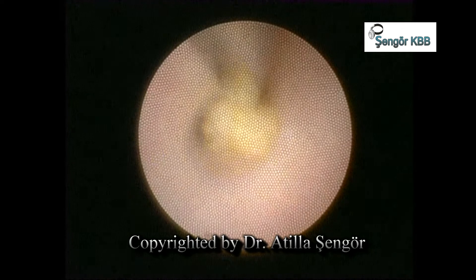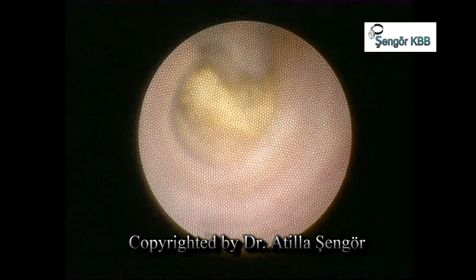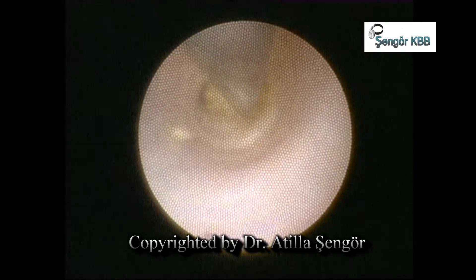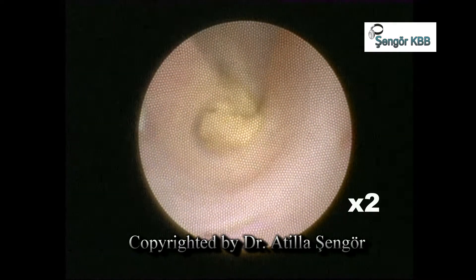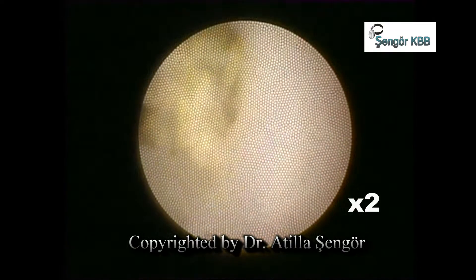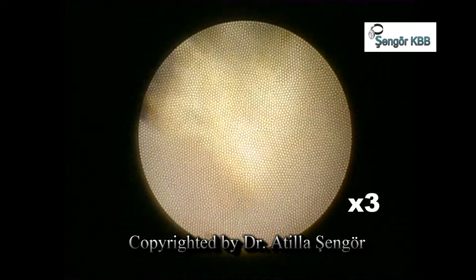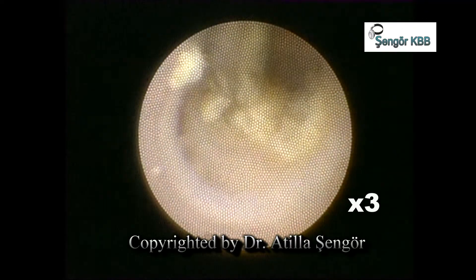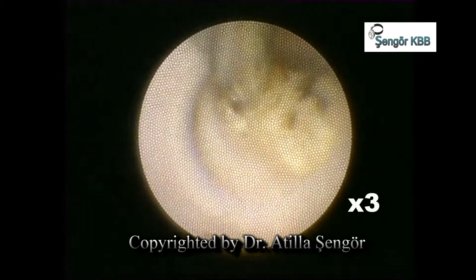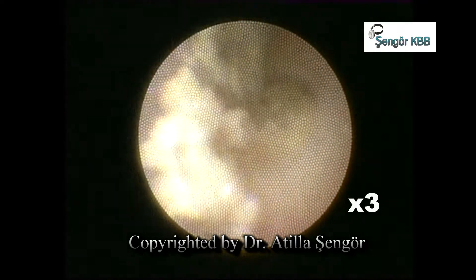I am making shots to the stone with a metal probe. As you can see, this stone begins to fall into pieces. I will show you faster because this is actually a 2-hour procedure, but don't worry, you will still be able to understand it easily. Here I show mostly fragmentation. In fact, I also cleaned these stone pieces — I am not showing that to avoid making the video longer.